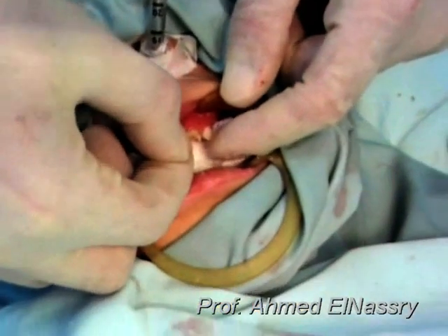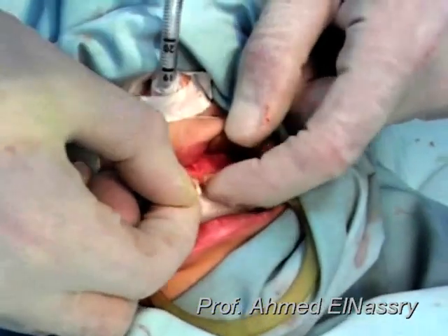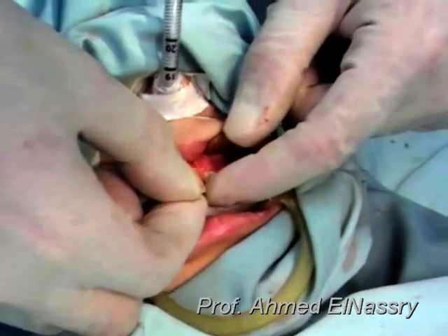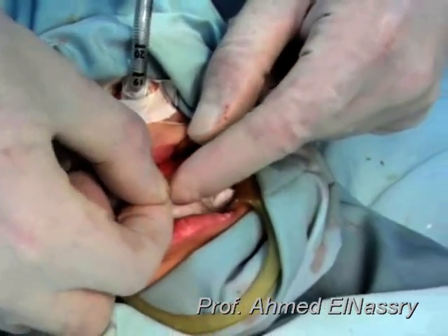Inserted on the tooth manually, gradually, adjusted to the correct position.